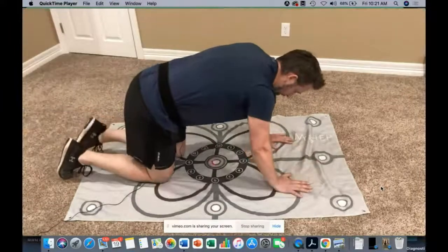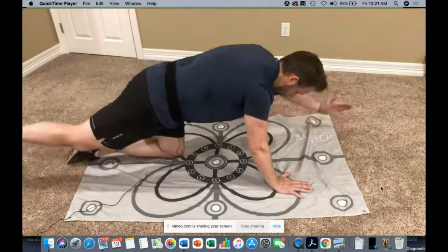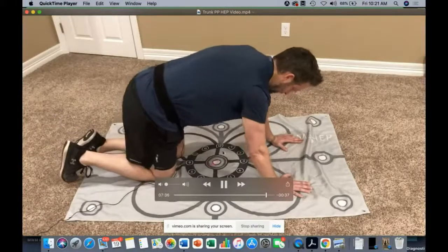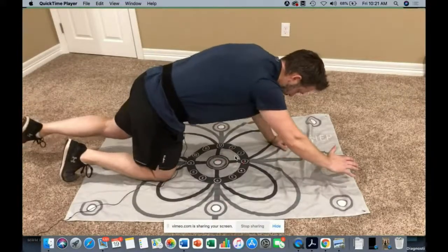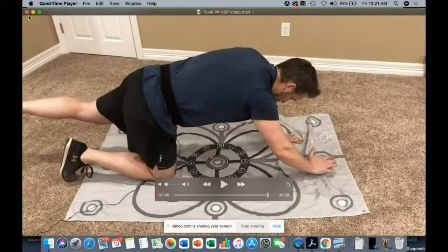You can implement this type of treatment and address that in a horizontal position rather than always just the vertical position. And of course, you can see me working on those number targets here and the motivation of being able to move and call those out with different patterns. Okay, as an application there.